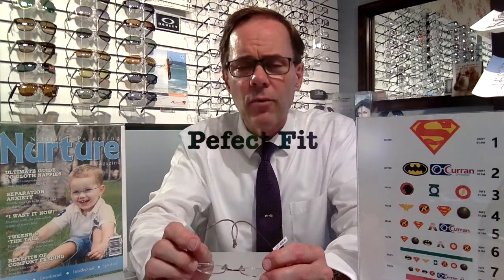Now when you receive the eyewear, it's going to fit your child quite well, but from time to time there might be a need to make minor adjustments to make for that perfect fit.